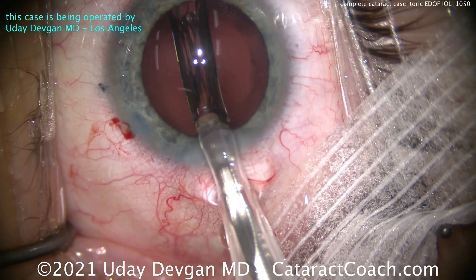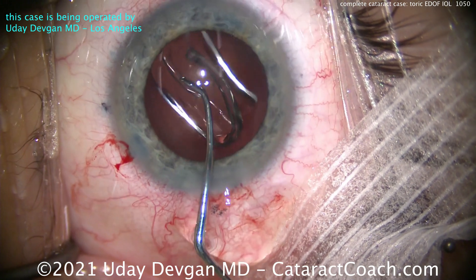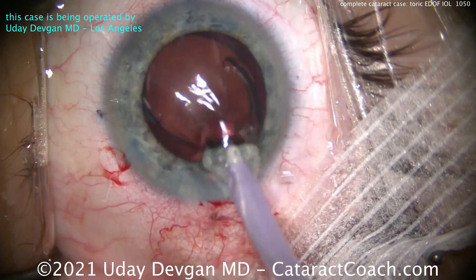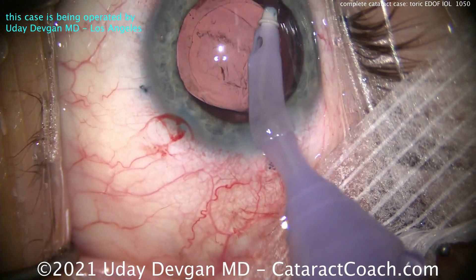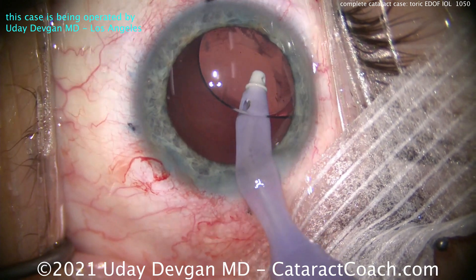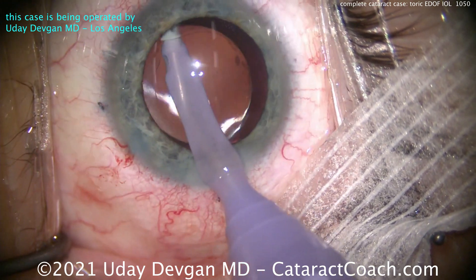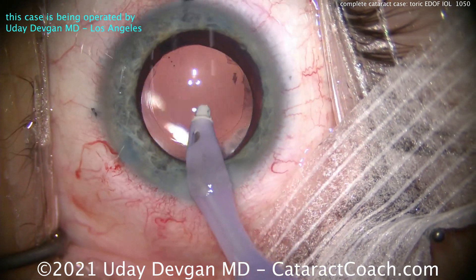It's perfectly fine. Remember, this patient relies primarily on his left eye for at least 75% of viewing tasks rather than splitting the eyes 50/50. So you want the best quality lens in this eye. The other eye will do very well by treating the anisometropia and making it also plano — both eyes will have a plano outcome. But remember, the other eye is limited by the amblyopia to slightly less best-corrected visual acuity. He's 40 years old, so whatever amblyopia set in by around age 10 or 12 is there for life.